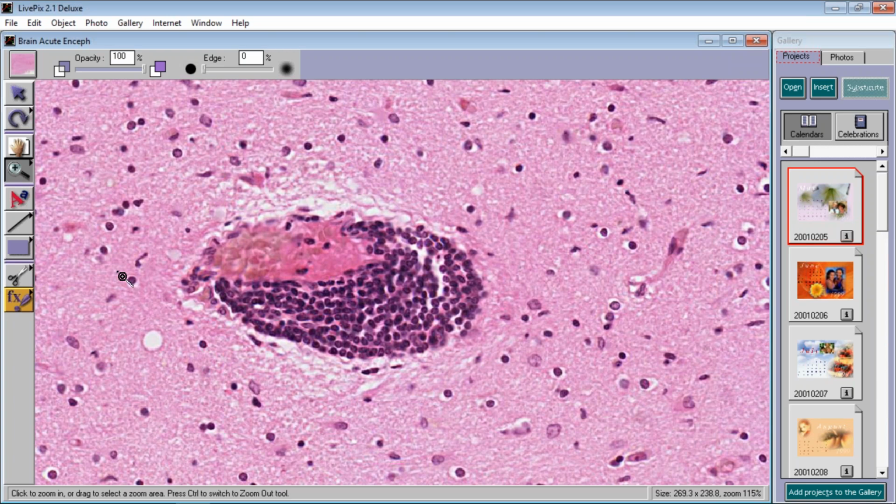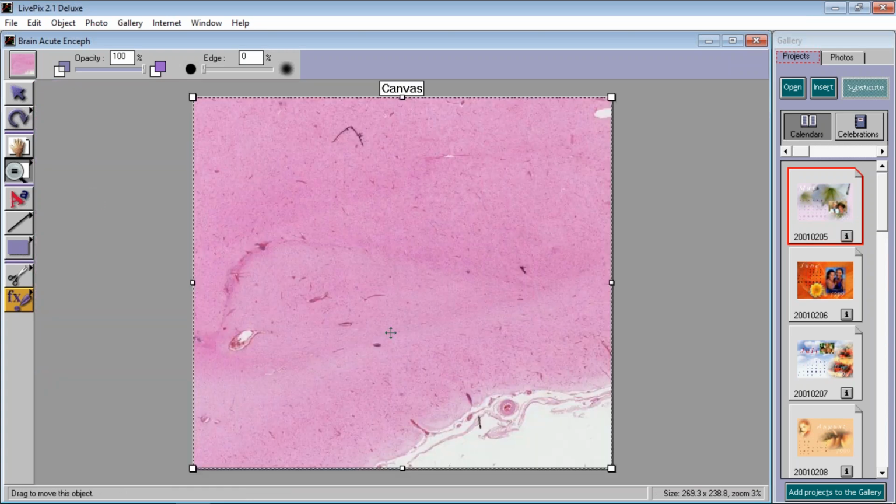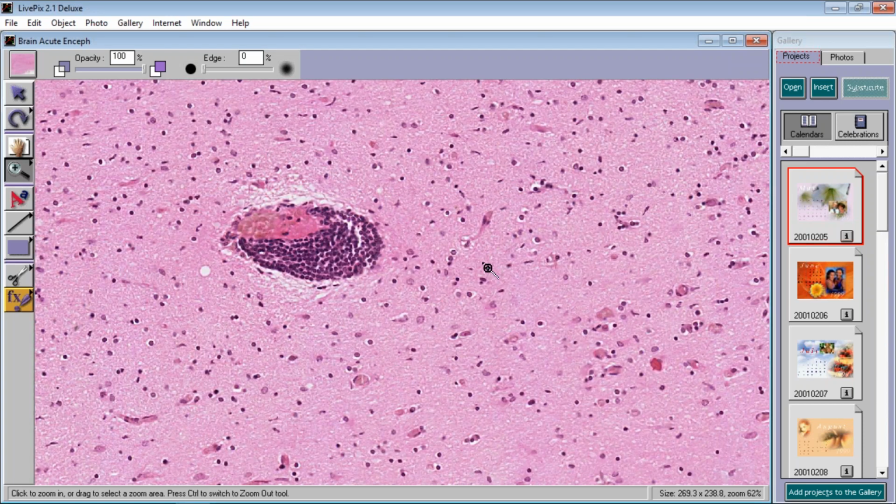So this is an encephalitis, okay, in which the meninges still look pretty good. And remember, in the meningitis, the brain looked pretty good. Now, I know what you're thinking. Your thinking is going along the lines of, if we call this acute encephalitis, then these have to be neutrophils. If we call it chronic encephalitis, these have to be lymphocytes. Well, you know they're lymphocytes, but the problem is this would be called acute encephalitis, even though the primary inflammatory cell is a lymphocyte, or something we associate with being chronic, because it is acute clinically rather than pathologically.